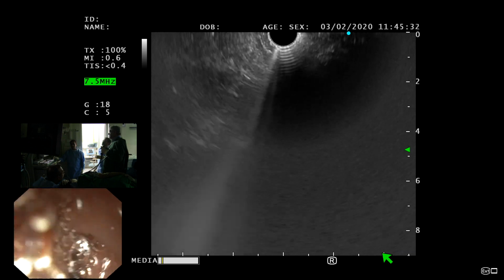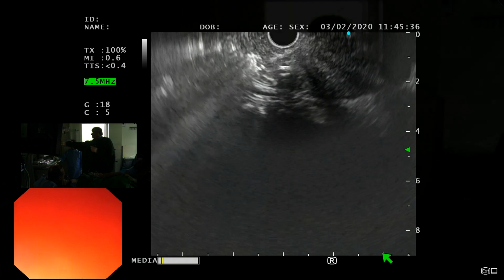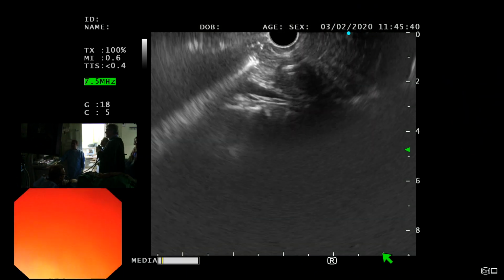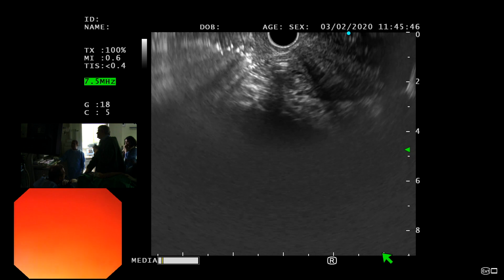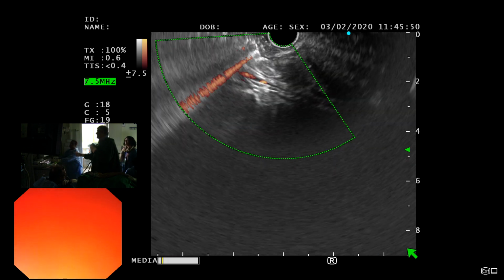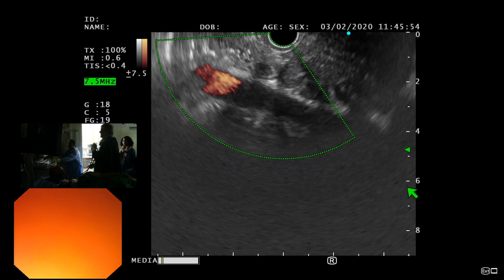Following it that side, that's the bile duct. Below that is the pancreatic duct there. So we'll go a little bit more. There is the pancreatic duct. Can you see the pancreatic duct? Unlike that one, this pancreatic duct is going towards the.